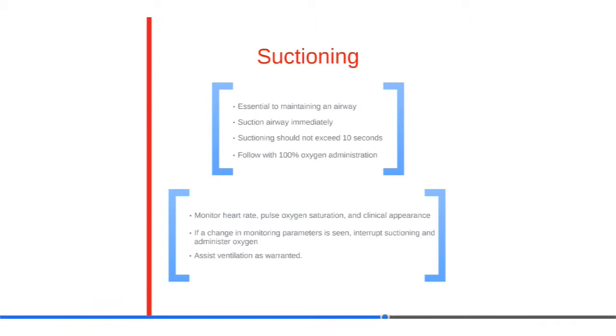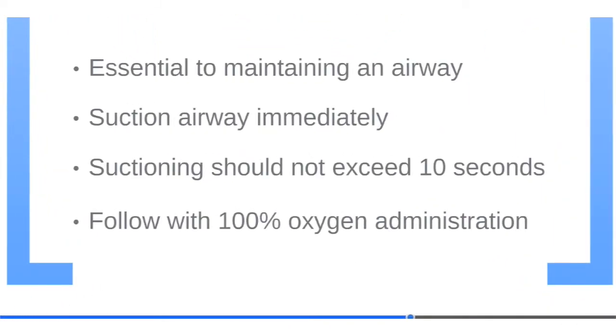Suctioning is essential to maintaining an airway. Suction the airway immediately if there are secretions, blood, or vomit. Do not suction for more than 10 seconds. To avoid hypoxemia, follow suctioning attempts with a short period of 100% oxygen administration.